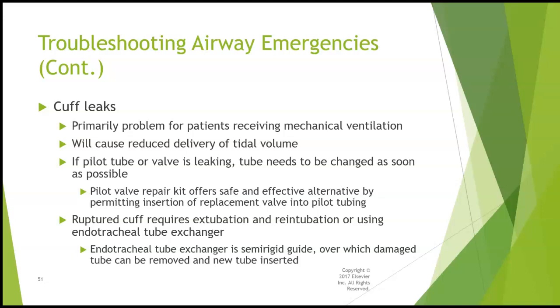If the cuff is ruptured, meaning the cuff has burst, that is going to require extubation and reintubation, or the use of, again, that tube exchanger. So the tube exchangers, you guys did that RCC for me already. Those are those long, kind of semi-rigid tubes. The blue ones are called bougies. I'll show you this in lab.